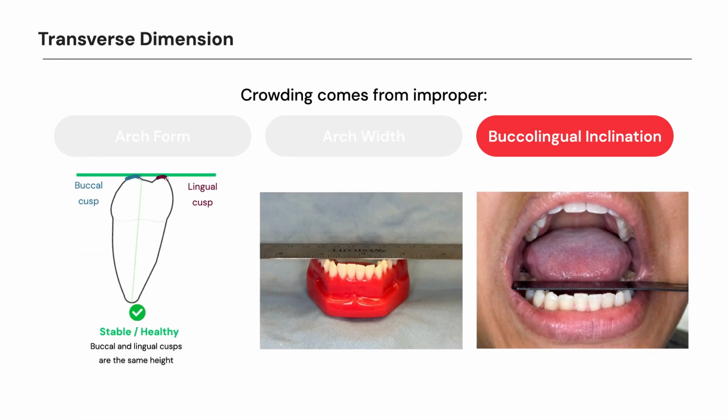So here we're looking at, again, just a ruler on a dentiform model, and that patient we saw previously with the cotton roll is here again. This is Morgan, our wonderful assistant, who's got a pretty smile, and we go ahead and drop the ruler on there. You can see that both the buccal and lingual cusps of these lower bicuspids are pretty darn even, meaning that the force going up and down is a nice axial or vertical force and helps to distribute things well.